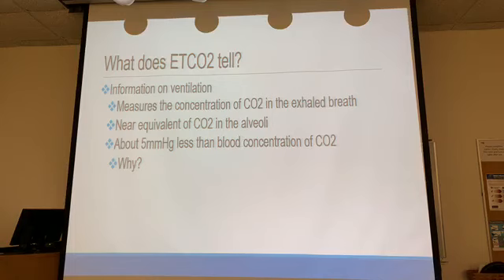Does that make sense? You guys understand why? Anybody explain that? Why is there a difference? Yeah, that's measured, arterial blood gases draws on dissolved gases, right? Would that be different? Well, why is the blood concentration of carbon dioxide and the measurement that we're taking, the exhaled carbon dioxide, why is it different? Why is there a difference of 5 millimeters of mercury in the two? Does anybody know? Is it the mixing of air in the dead space? No. Is it because your blood's producing the carbon dioxide at the source?